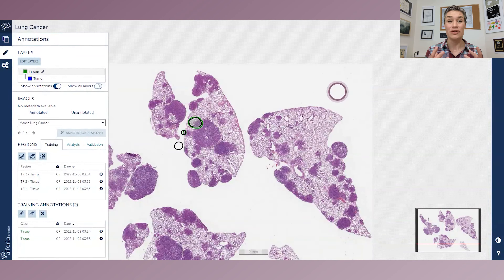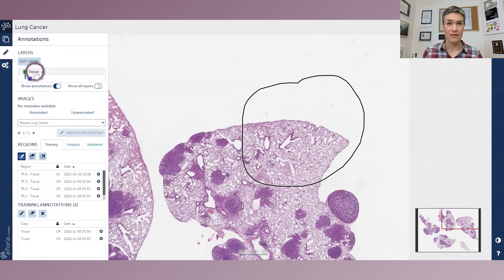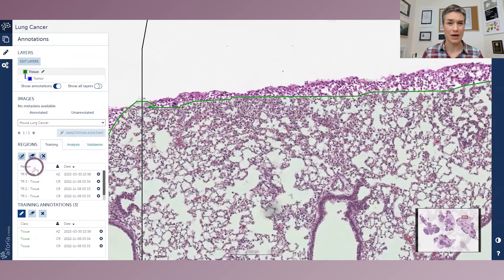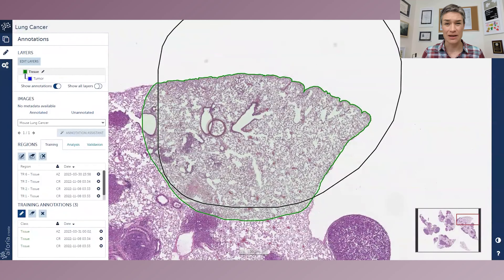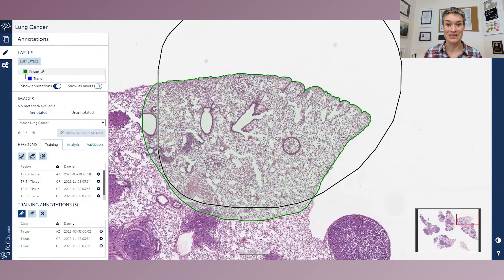In this part of the layer tree, the neural network is going to be detecting tissue and non-tissue. If we wanted to train in a particular region, we have our tissue class switched on and we know where our tissue is. We need to be precise with our annotation, because within the training region, everything outside of the green annotation is the background — the non-tissue — whereas everything inside the green annotation is the tissue. The network can then learn the appearance of non-tissue and the appearance of tissue.